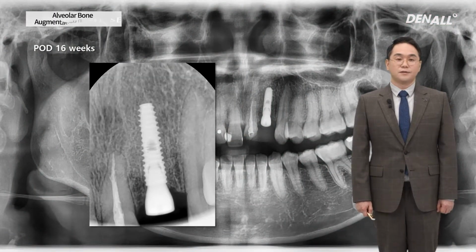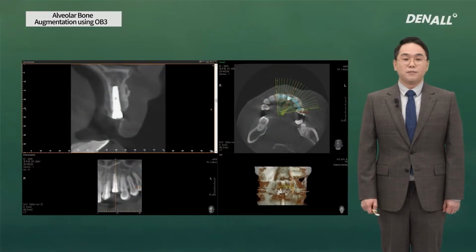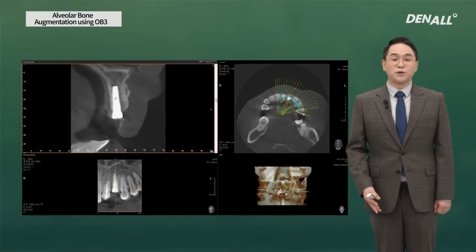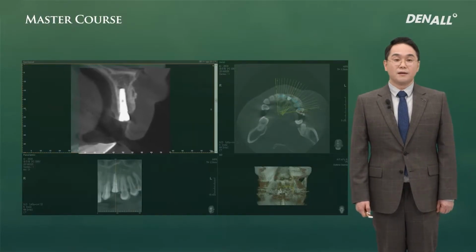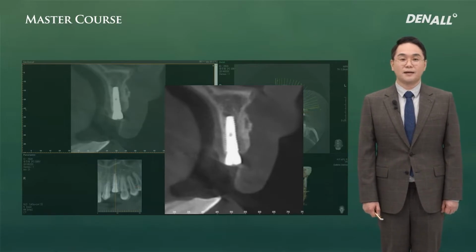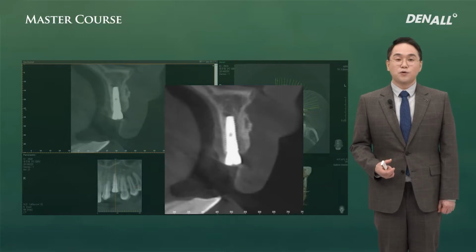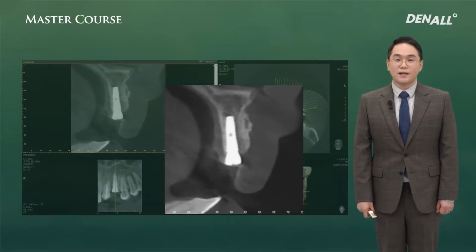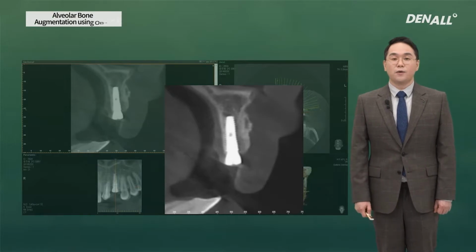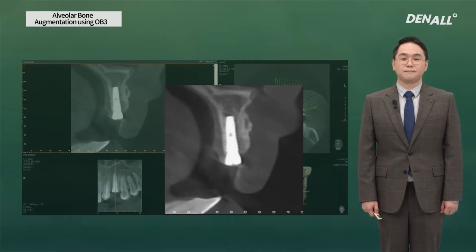Post-op panorama and PA. CT after placing the implant. As you can see, outside, the low temperature sintered EOS xenograft was positioned, so it is not resorbed, and the augmented labial bone volume is very well maintained. So when the defect is very wide-ranging and unfavorable, or more stable bone regeneration is desired vertically or horizontally, this special type of OSSTEM, the Jawbuilder, can be a good option to use.